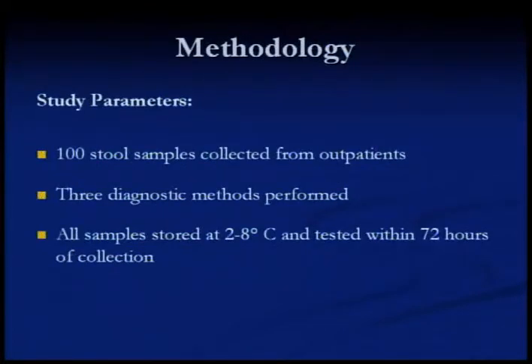For this study, 100 stool samples were collected from outpatients and transported to the lab in Cary-Blair preservative. Three diagnostic methods were performed on each sample for the detection of Campylobacter species. All samples were stored at 2 to 8 degrees Celsius and tested within 3 days of collection.